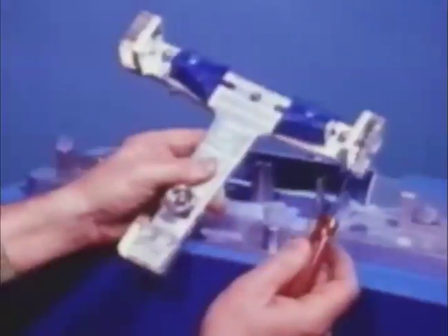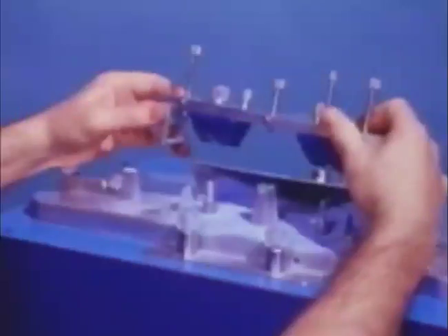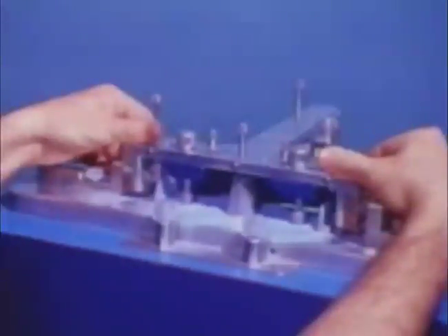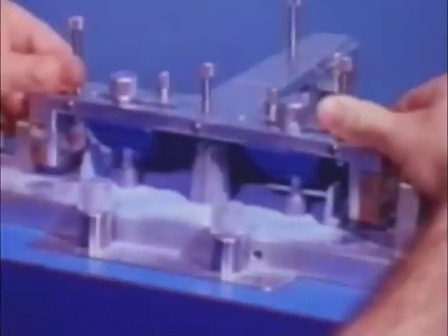The pointer is indicating that the patient's recording blocks have now been reversed to expose the lateral border recordings to the guide pins. The analogs are repositioned over the vertical mills in centric relation, and the guide pins are inserted into the lateral border recordings. The mills are activated and the border movements are pantographed. Here we see the right recording with an analog being generated on the left. Note the backlash effect in the recording was caused by the pivotal action of the working condyle. Observe that the Bennet and orbiting paths are magnifications of the movements at the condyle level.